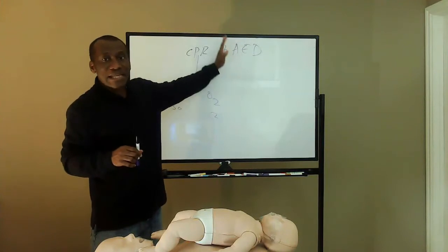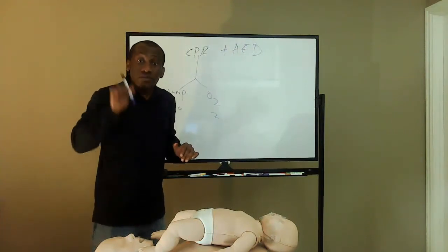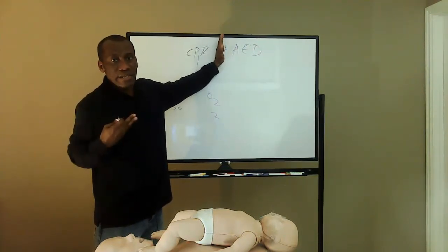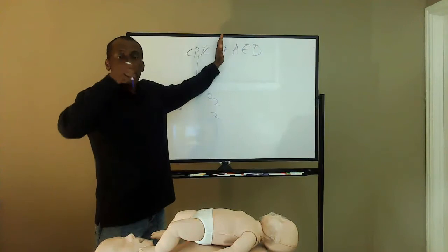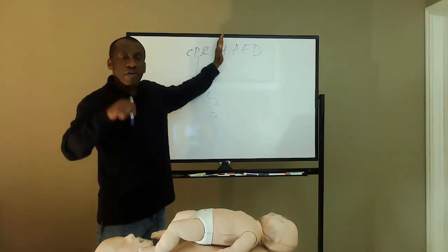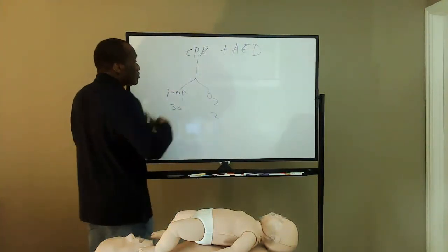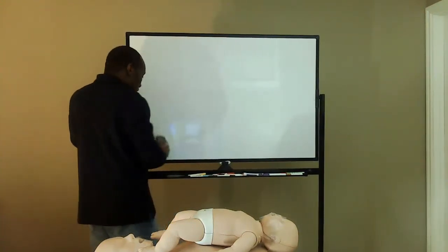Chances are that the AED may not be there at the beginning, but if the AED is right there, use it. Somebody may start with CPR alone at this time, but you need to request an AED. And as soon as the AED comes, you have to use it, because it is going to increase the chance of survival as a result of the eradication of the root cause, the unstable, abnormal heart rhythm. Now we have seen the reason why you need to bring an AED.